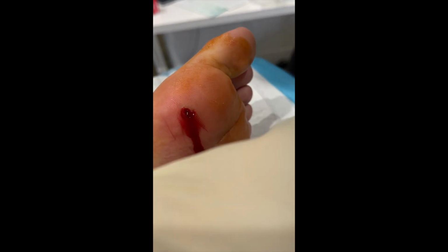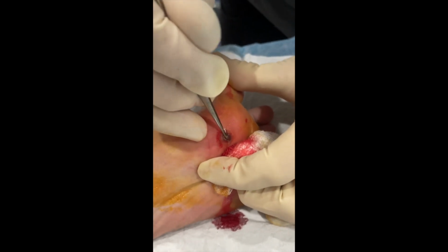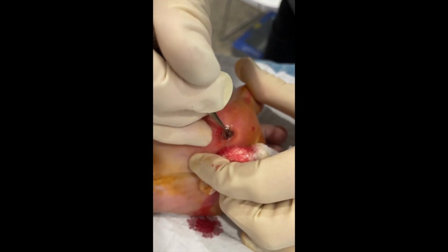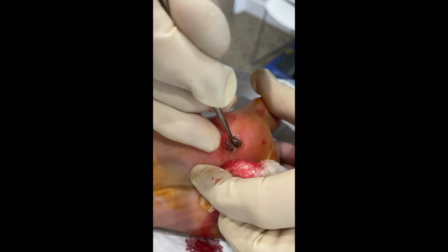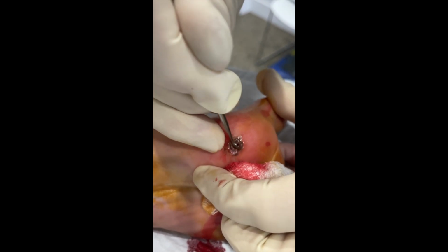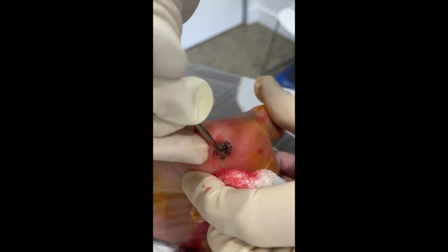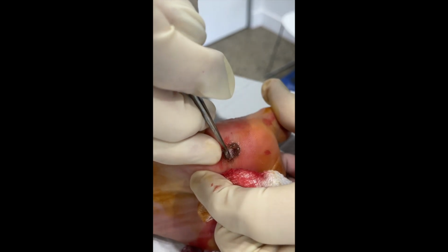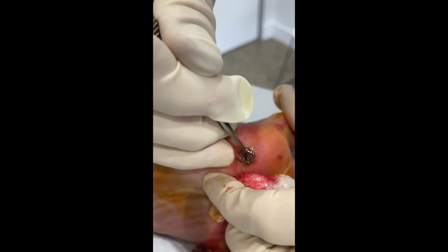Once we're happy that we've got all the infected tissue out, we then apply phenol to the area. So this is done again with the curette. The phenol is an acid type of liquid that aims to kill off all the rest of the infected area, but it also helps cauterize the nerves as well, which means that after this, it doesn't tend to be too sore for the patient.